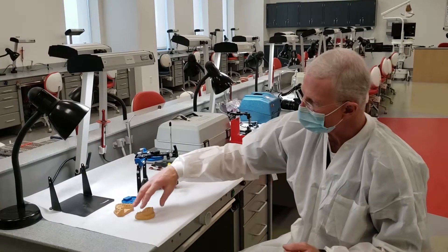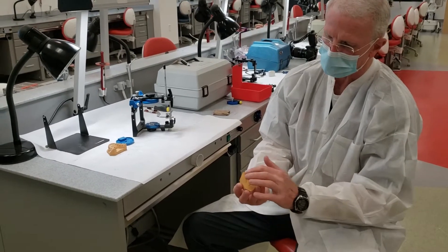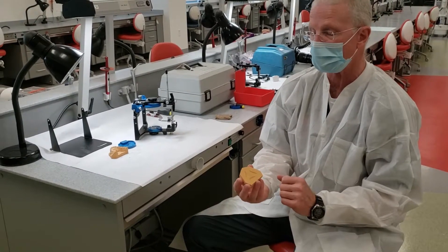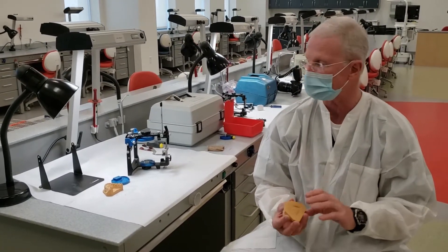Because we're indexed on the internal portion rather than at the edges, we're going to focus our mounting stone in the center point, so that if we have to remount, it's very easy to separate the cast later.